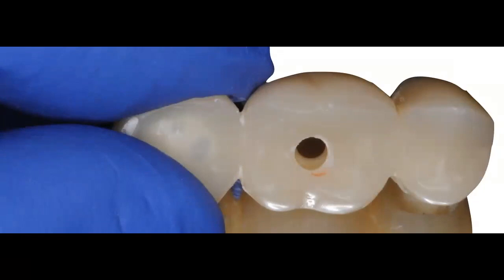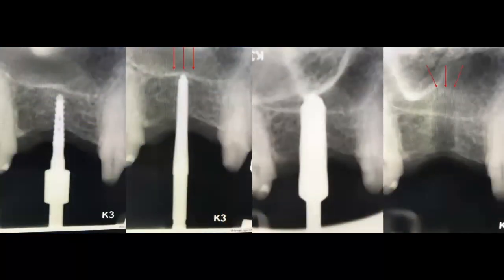My goal is to use this little temporary as my guide for my pilot drill. So I know that with this in the patient's mouth, I'm going to use my 2.0 pilot drill, and I'm going to create that initial osteotomy that is going to give me the exact direction that I'm going to need for the subsequent drilling sequence.